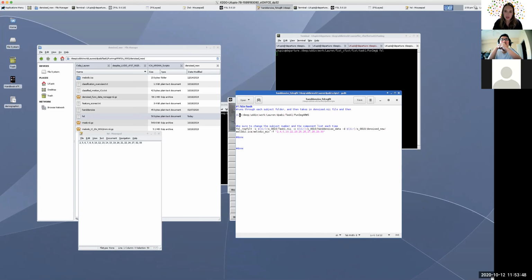So what you're going to do is, again, change your directory to wherever your preprocessed data was. And then in here, you're going to use the regfilt command. And then from the directory, go to your subject. And then your preprocessed data, so not the melodic ICA, goes here. So just your preprocessed NII file.